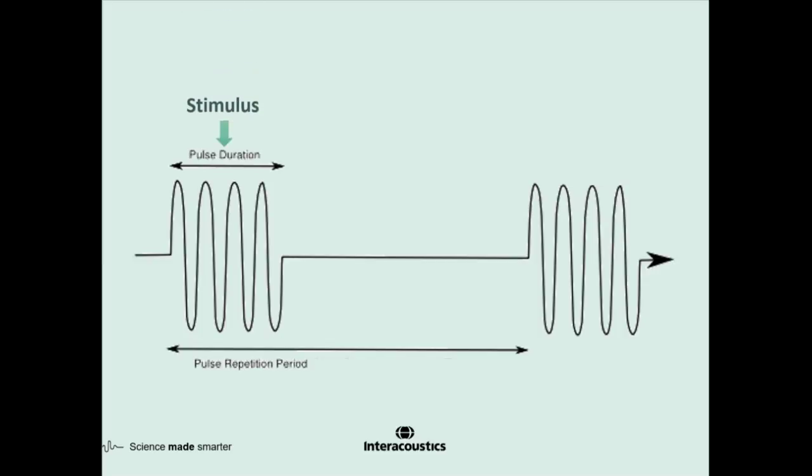So we can present a stimulus, and then we can stop the stimulus temporarily and measure the response in the silence between the stimuli. Now, this diagram actually is an indication of how people use ultrasound to image the body, and they've got the same problem, which is that they are looking for a very faint reflection from the interfaces between organs inside the body. And so they use the same technique. They basically send in a stimulus and pause and listen.